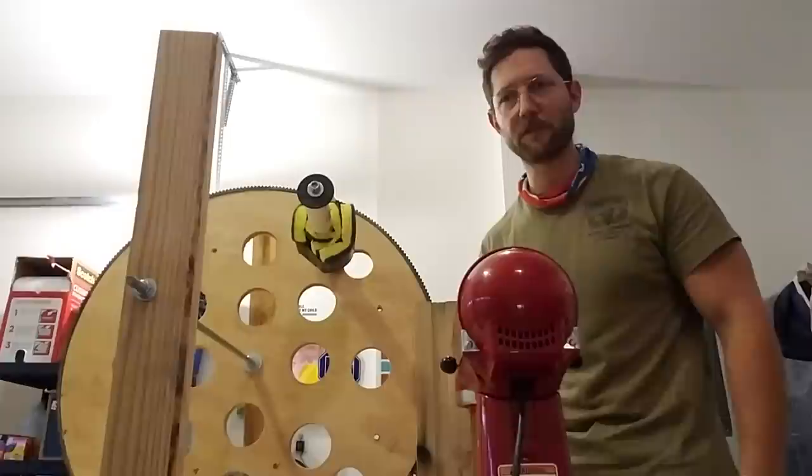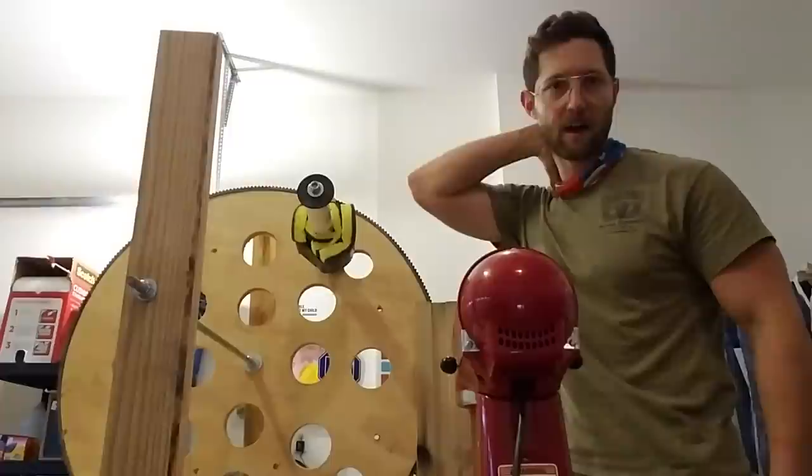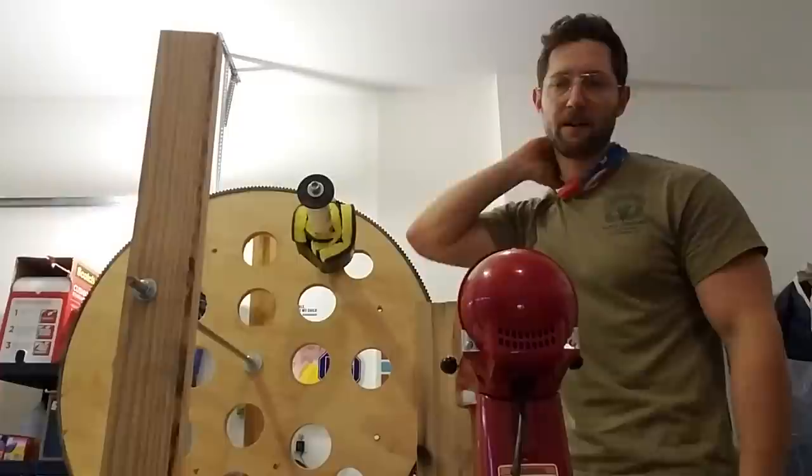I apologize ahead of time for this video and what's going on. I haven't slept in 48 hours, but what I have done is I have built an ICU mechanical ventilator using a heavy mixer and supplies that I bought and made from Lowe's Hardware.